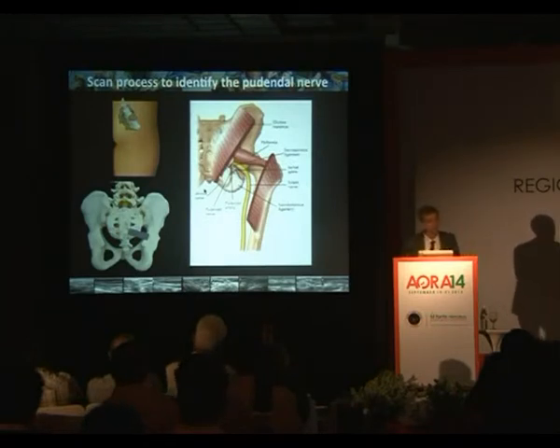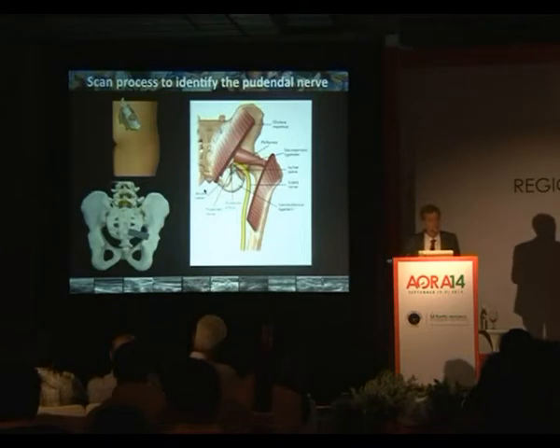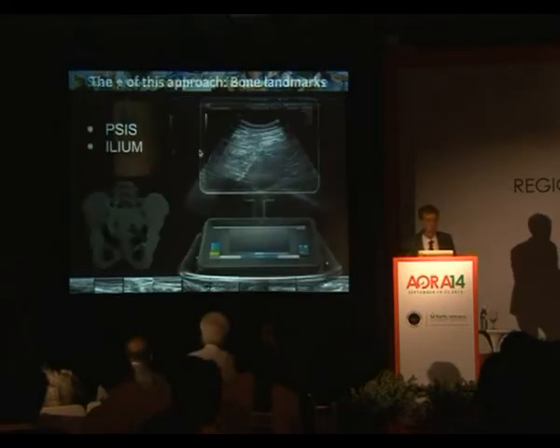the pudendal nerve block. It's an elegant way to perform a pudendal nerve block in a lateral position or in a lying position. We don't need anymore to put the patient in the lithotomy position, and we will do the block here, and we will have this image, the vessel, the pudendal artery, and then you have the nerve. This is difficult. This is a nerve difficult to find. You need to have the color Doppler in this case to see the pudendal arteries.